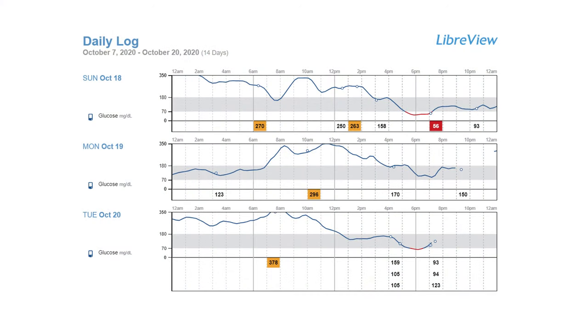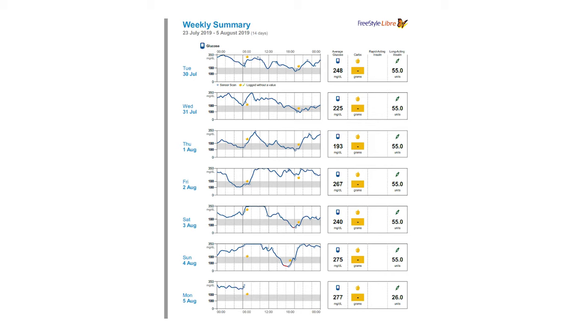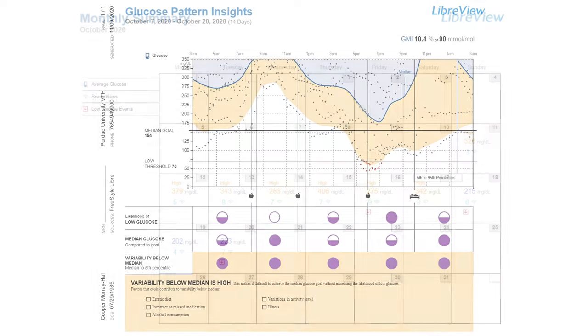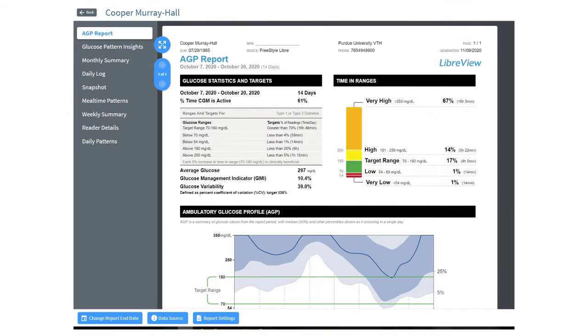The daily glucose curves that are generated by the Freestyle Libre sensor should be interpreted similarly to traditional blood glucose curves. The duration of insulin action and maximum blood glucose lowering effect, or the nadir, should be assessed. The LibreView software also provides a summary with daily average glucose concentrations, insights into the glucose pattern over time, which can be used to assess the average insulin response, and information about how much time the glucose concentration is very high, high, in target range, low, or very low.